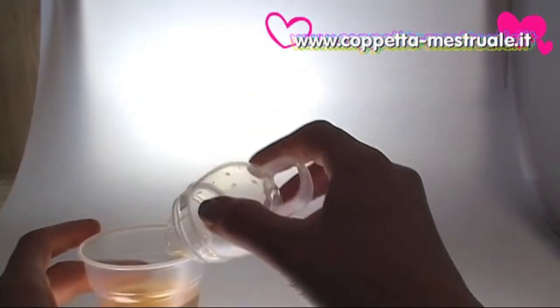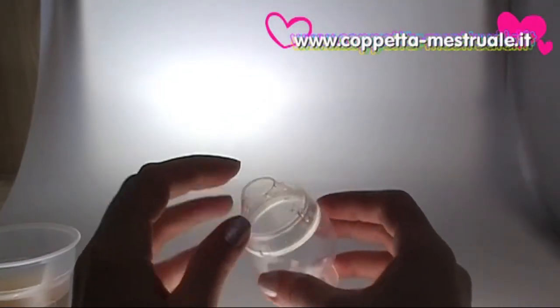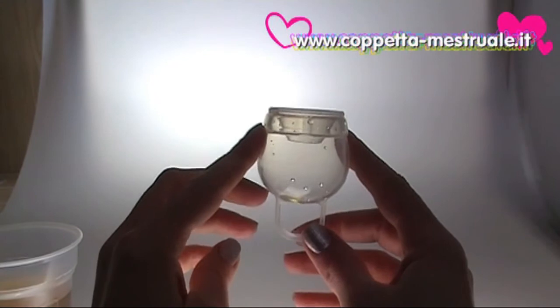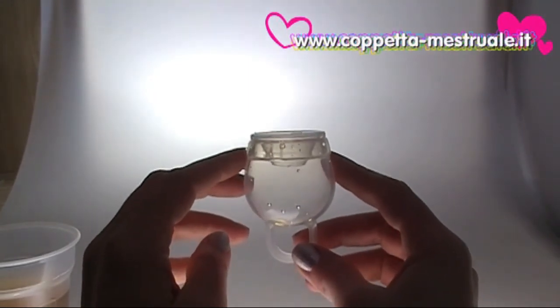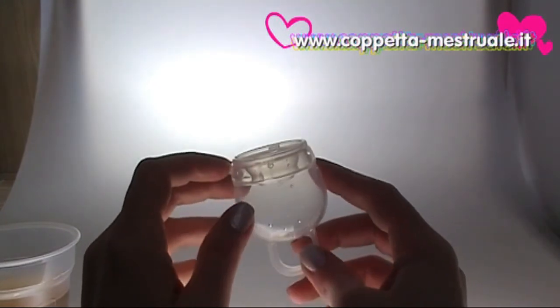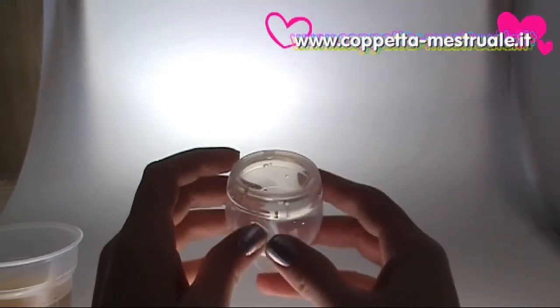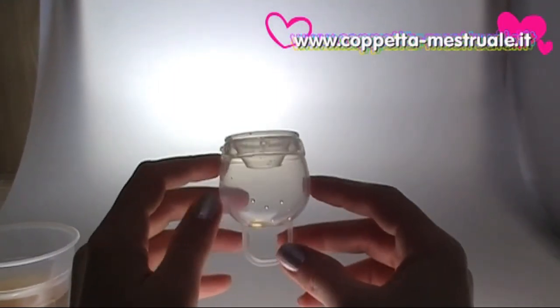Then you can rinse it with a bit of water, put it in the bag provided, and insert your second Femicycle. Because it has a wide bottom, even women who have just had a baby can wear it without worrying about it falling out of place if they cough, sneeze, or use the toilet. The Femicycle is also short, so if you have a low cervix, it will still work well.